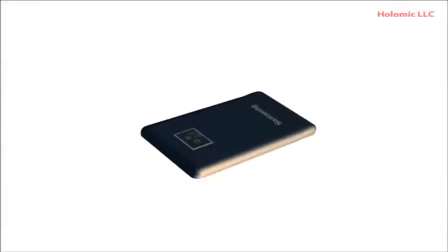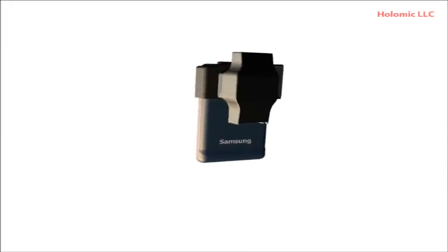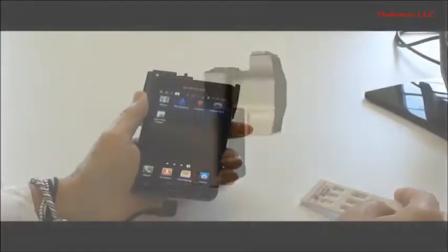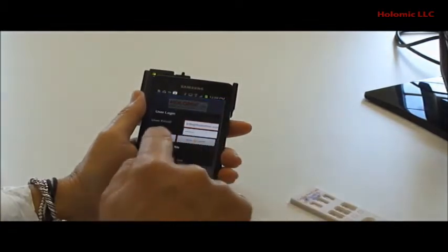But imagine that you have 10 of them working with you for different conditions, so that you want to rapidly diagnose different conditions. Then it becomes tedious, and of course you may start to make mistakes because of the control lines, and the tests of these things vary from manufacturer to manufacturer.